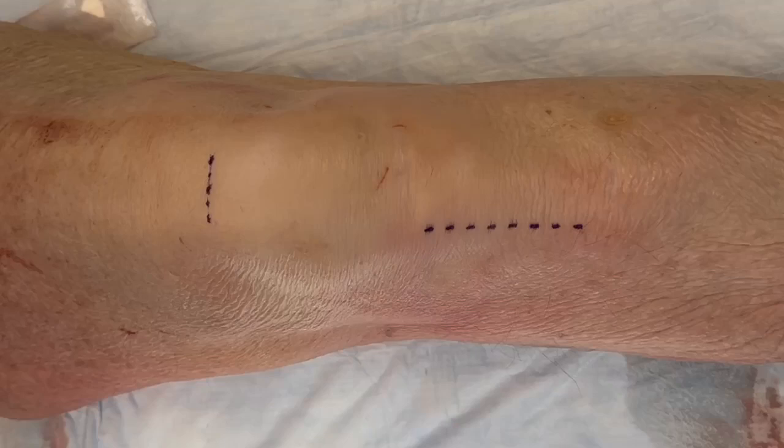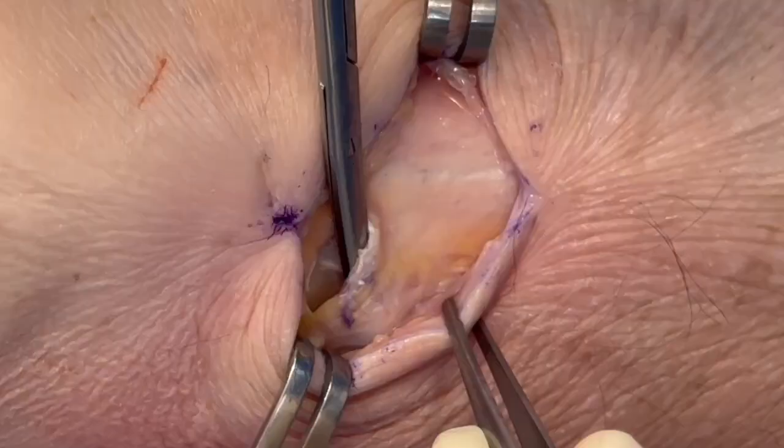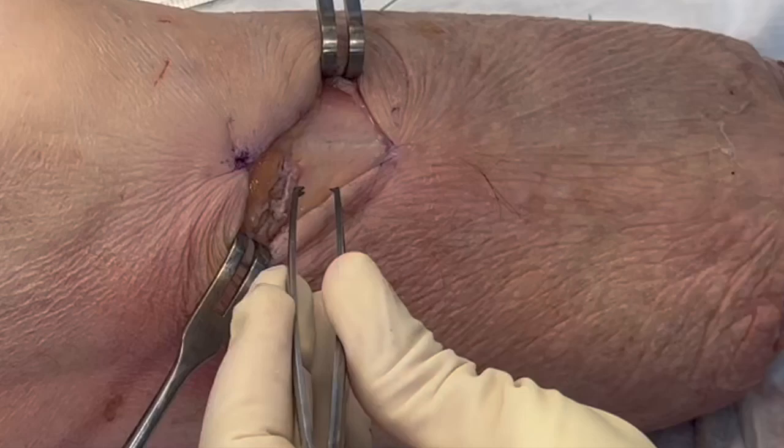The technique for the HTO can either be above the tubercle or, as I'm showing here, below the tubercle. You can reuse pre-existing incisions, for example, from a prior BTB tendon harvest, but the incision should be roughly midline because you need to approach both the medial and the lateral aspect of the proximal tibia. This shows you the incision along the anterior medial tibia, opening flaps, exposing the pes medially.